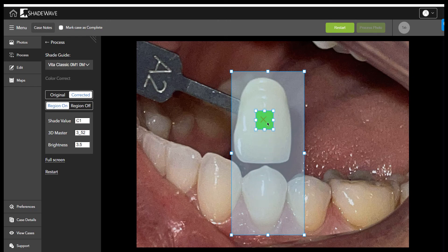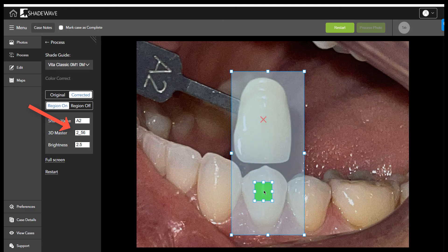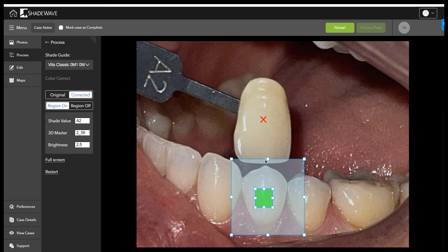Now let's click on the shade tab and see what that tells us. It's a 2 — so it's saying that in brightness, the shade tab is actually brighter than the tooth. Let's go ahead and get our full analysis.